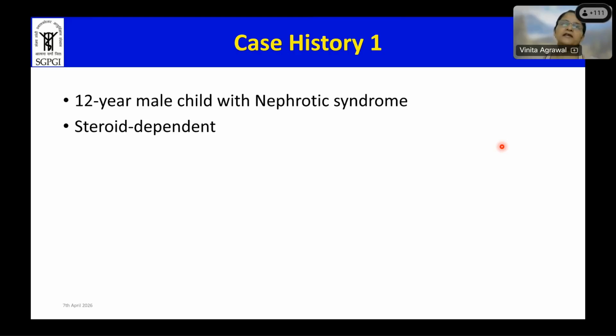For example, you have a renal biopsy in which you see 1 glomerulus showing amyloidosis. You can, of course, make a diagnosis. Or, for example, membranous nephropathy, you can make a diagnosis. It will be difficult to make a diagnosis of FSGS or other lesions if you just have 1 or 2 glomeruli. So this is basically relative, but yes, that is the adequacy criteria for native renal biopsies. Thank you, Sheetal, for pointing that out. Thank you, ma'am.